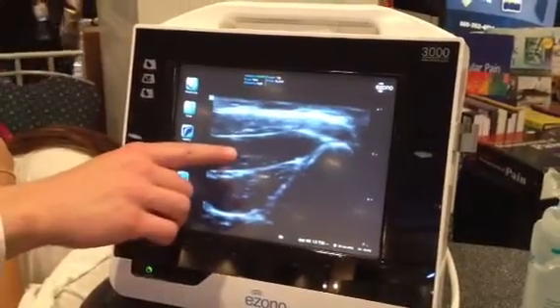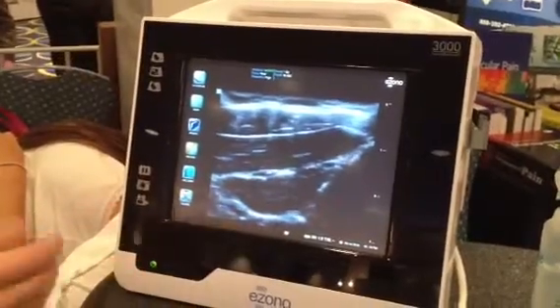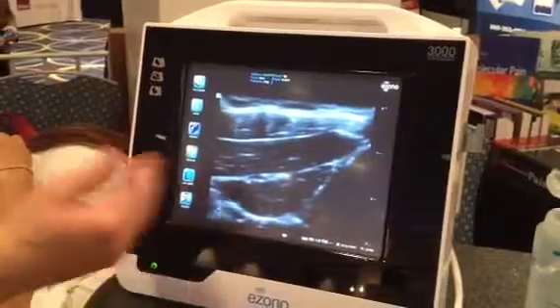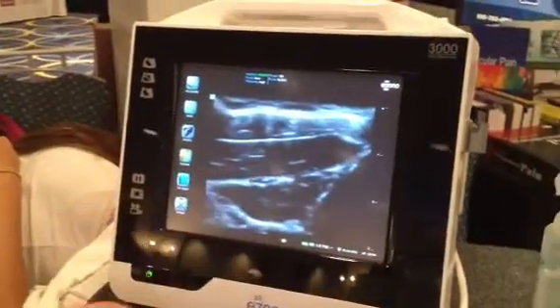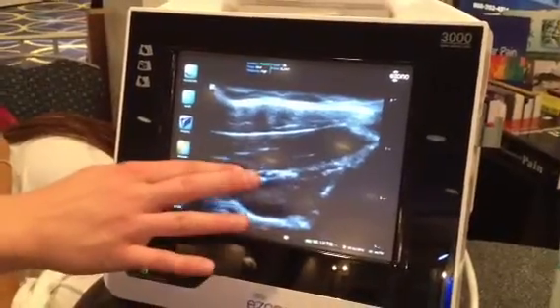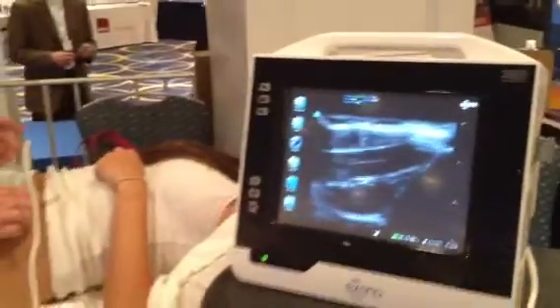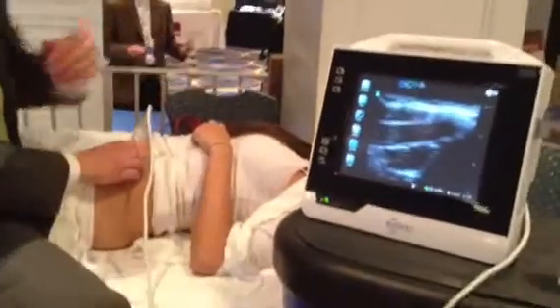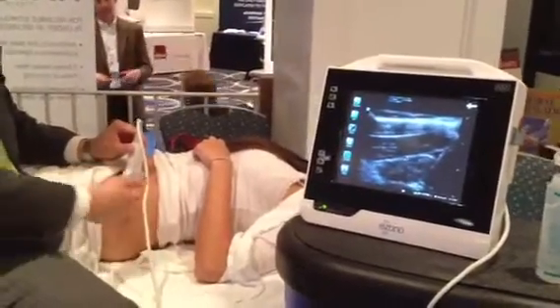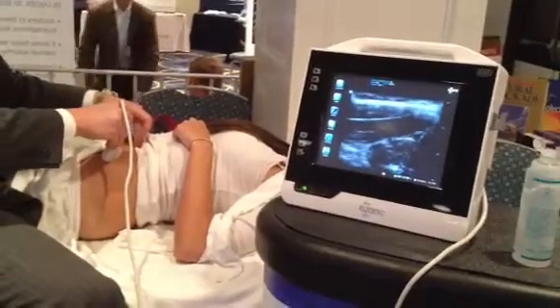Between the internal and the transverse abdominus, I see this structure here. It's not really important to identify the actual nerves, although here we can see them — they're right here. But it's important to identify the fascial plane between the internal and the transverse. Here's our target on the ultrasound screen, and you can note the angle of the transducer — it's coming off of the bone and angled towards the belly button.